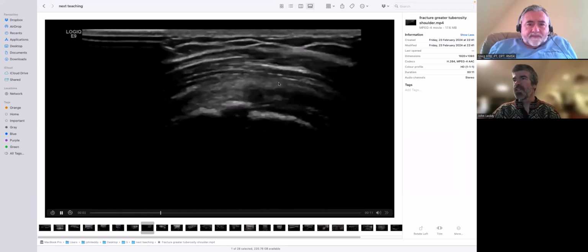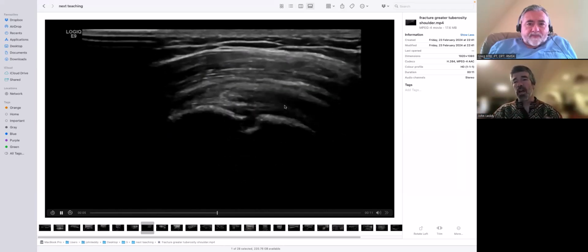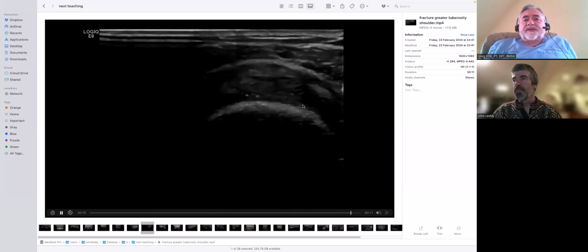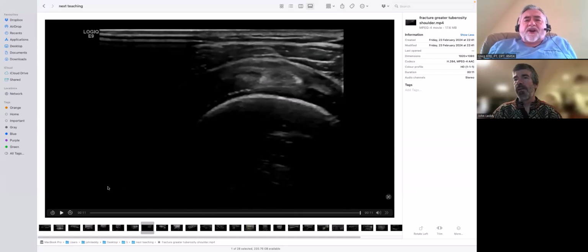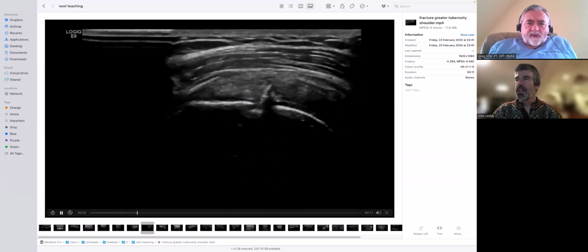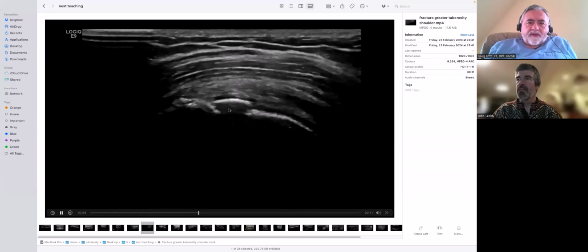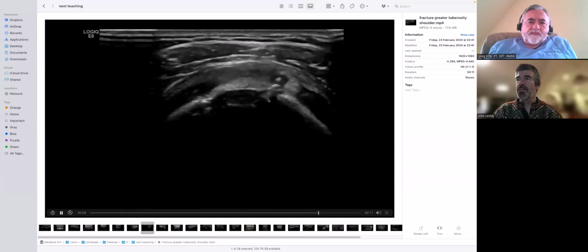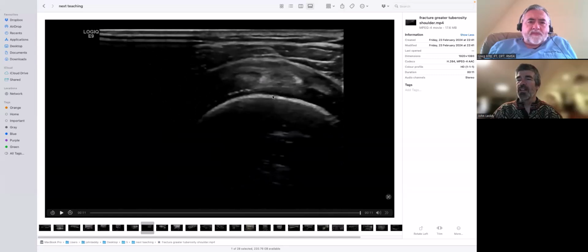Just direct, probably a trauma directly from the acromion, I think, and it's just enough. Is that a sharp shard? Simply a tilted cortical piece, that would be my best guess. It just lifted up, flaked off, probably with traction from the supraspinatus at the moment of impact, or something like that would be my best guess.